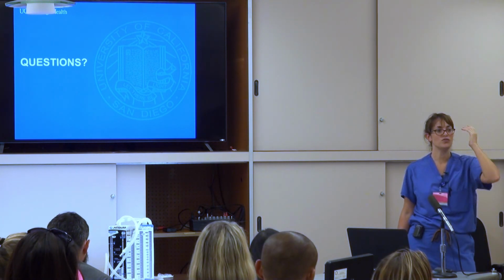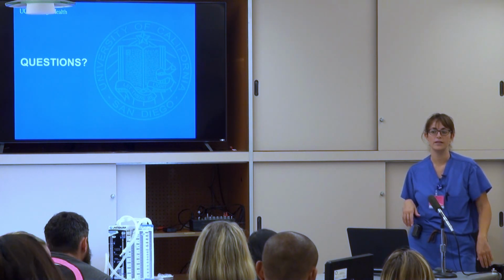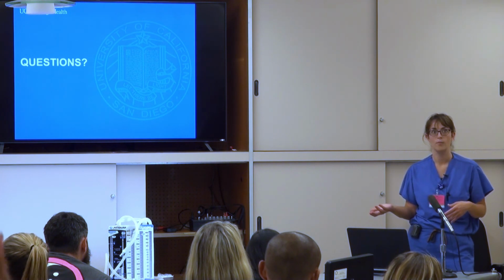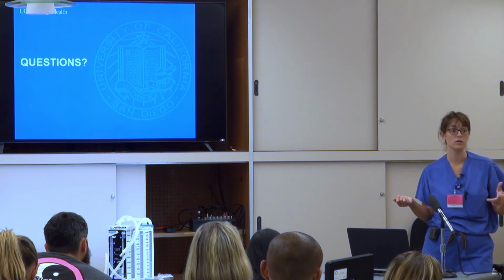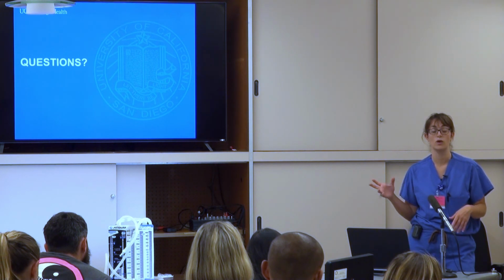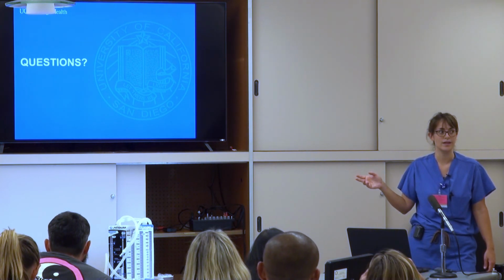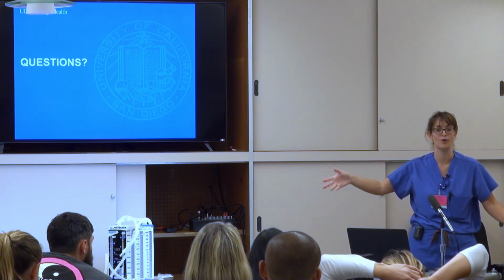Yeah, so that you know, this is not unique to the trauma bay. It's not just that they're giving us ones that aren't working. It is a universal issue because these are reusable instruments. The people who are doing the sterilization are supposed to check everything before it goes into the kit. But they aren't the surgeons using them or the scrub techs who are using them. And so sometimes that level of oversight or understanding that it's broken may not be there. And sometimes accidents happen. So the unfortunate aspect of this is that we don't know that the tray is broken or doesn't have enough pieces until you pop it open in an emergency.